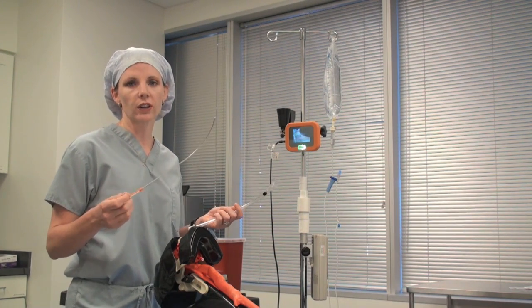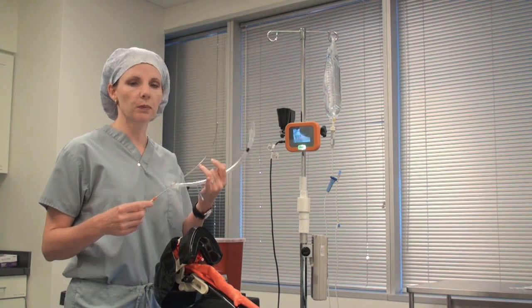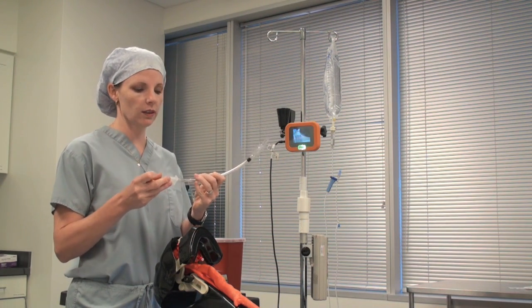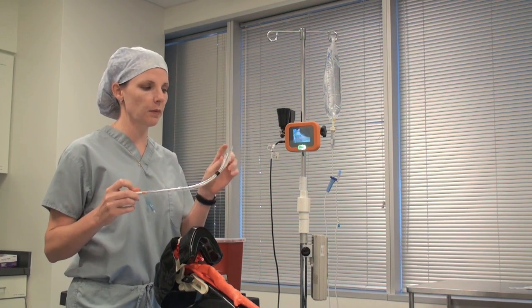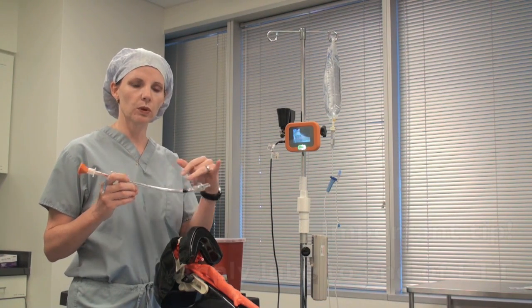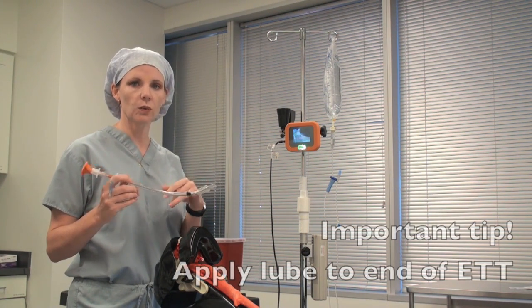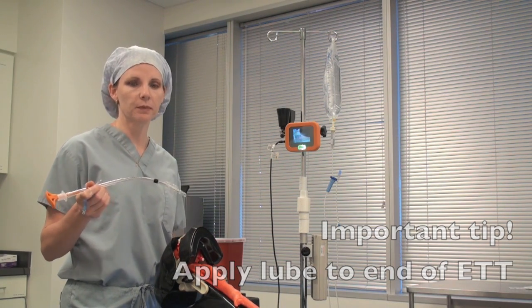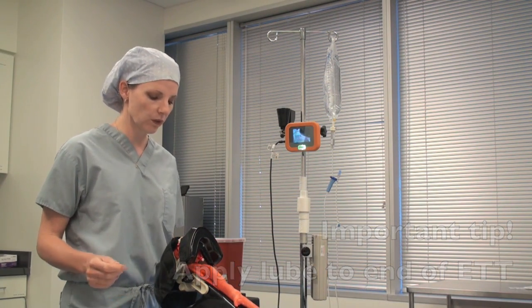To prepare your endotracheal tube, get your rigid stylet. You may want to put a little bit of water soluble lube on it, then put it in your tube, making sure that the end of the rigid stylet does not extend past the Murphy eye and out the end of the endotracheal tube. I also like to put a little bit of water soluble lube on the end of the tube, as it helps the tube make the turn past the patient's lips and teeth a little bit more smoothly.